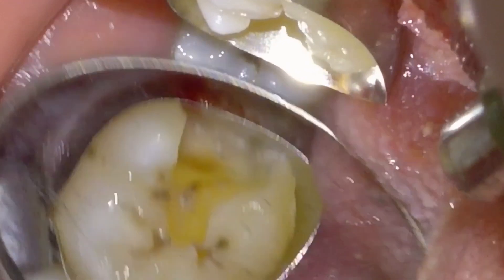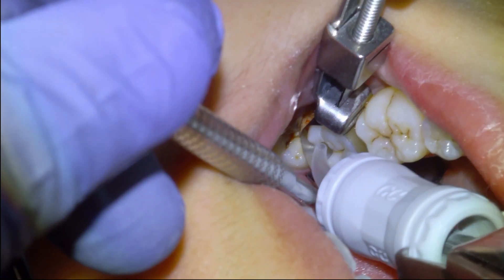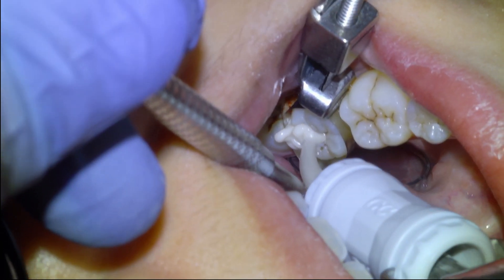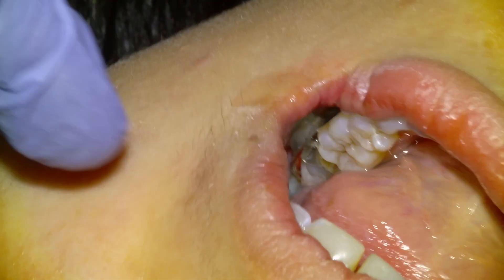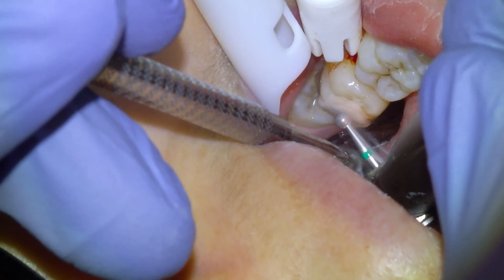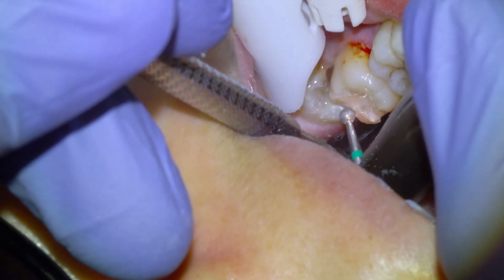There's the final prep. This is a bonding protocol that has worked very well for me, and I've seen evidence in the literature that says it's equivalent or better to a polyacrylic acid scrub. I'm going to give the Equia Forte about four minutes to set, then remove the matrix band and begin removing the excess restorative material with a large round diamond burr.